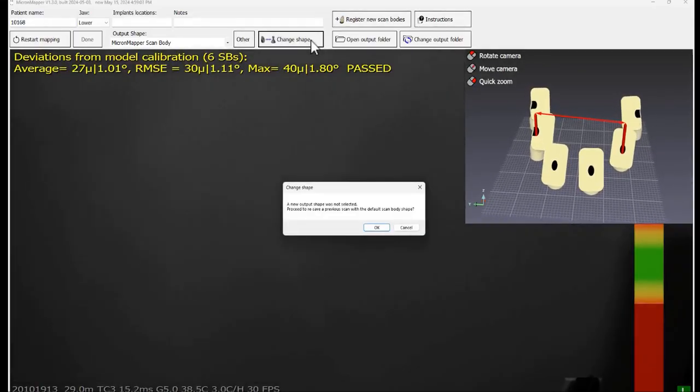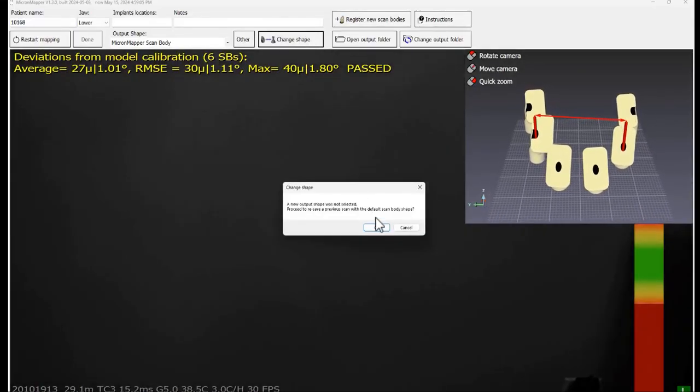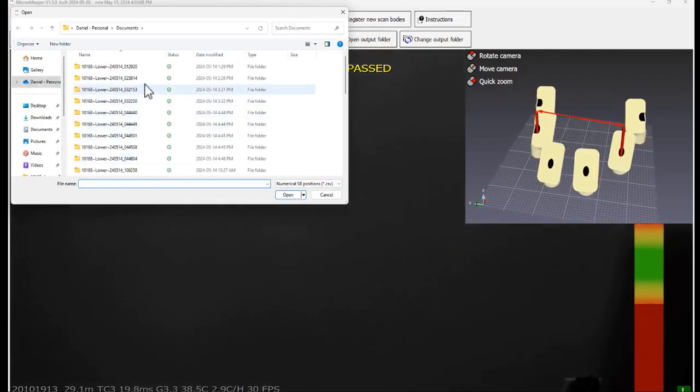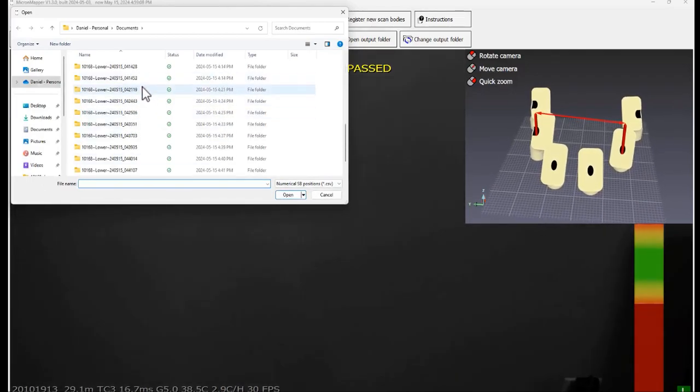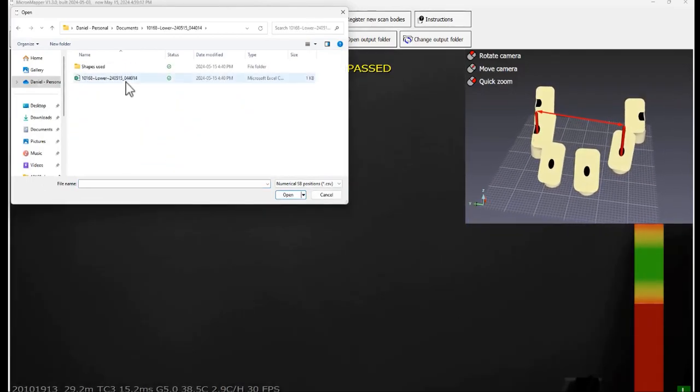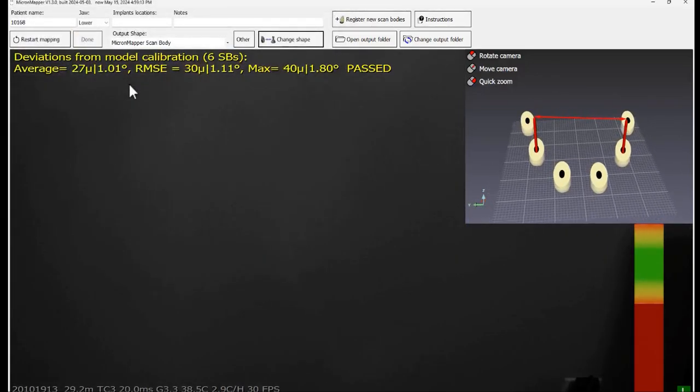Simply select the shape from the drop down list, click on the change shape to select the CSV file you want to resave it with. And now that you are familiar with the basic Micron Mapper EVO workflow, there are some additional features for you to learn.